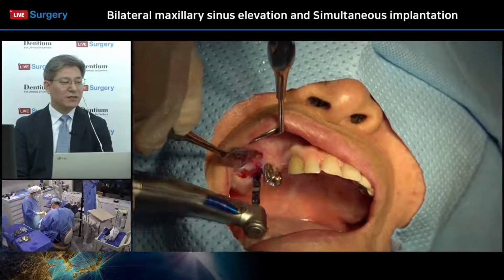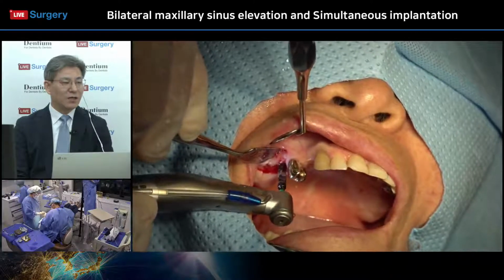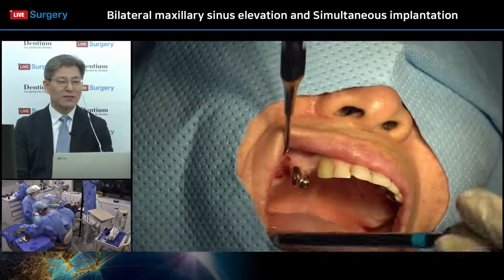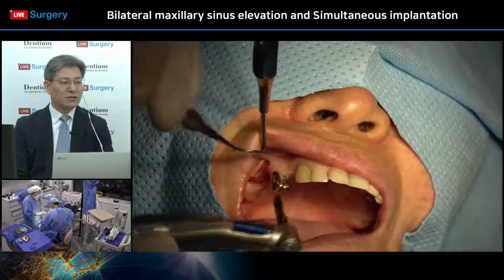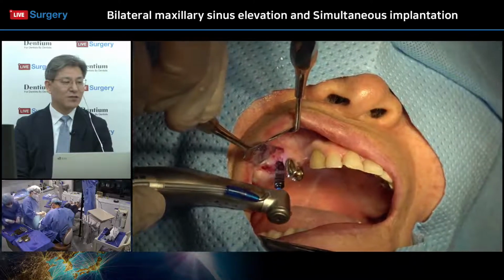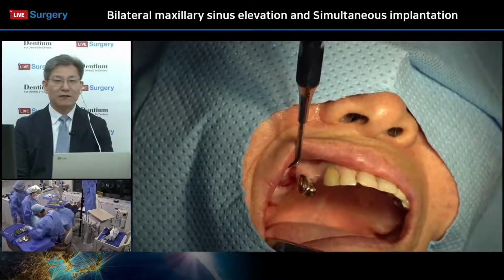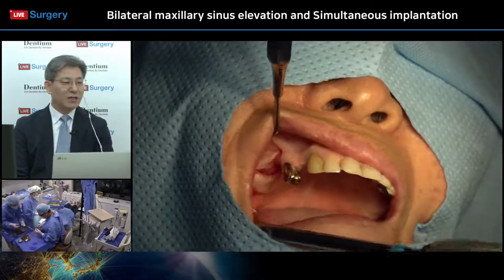This area could be placed with the bone level implant of the Bright system because of submerging the implant fixture. So he has decided on a diameter of 5.0 and a length of 9 millimeters.